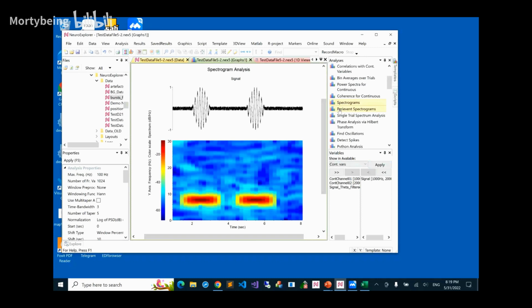But what you can do here is calculate the spectrum of the signal after the first stimulus, then the spectrum after the second stimulus, the next, and then average them. After you average over 100 stimuli, you have a visible presence of a specific frequency, for example, theta rhythm.